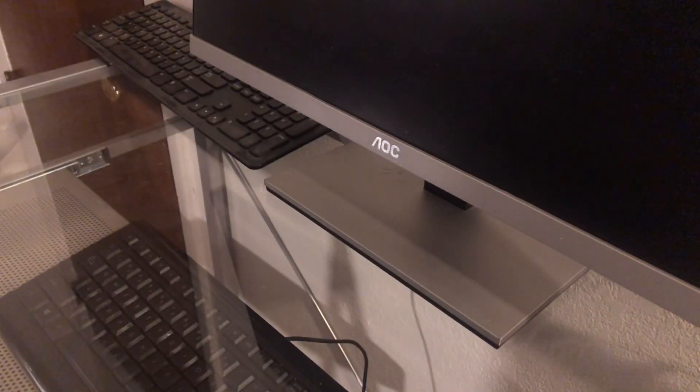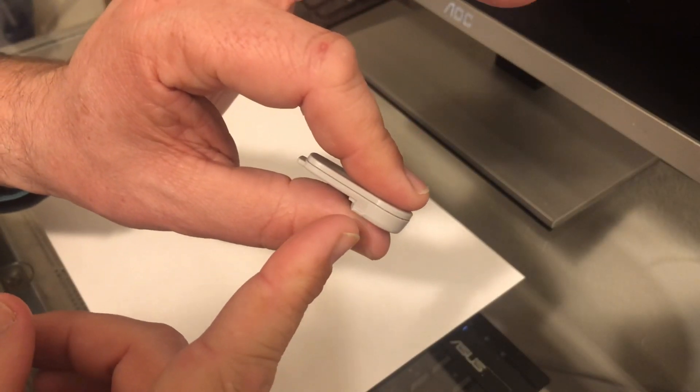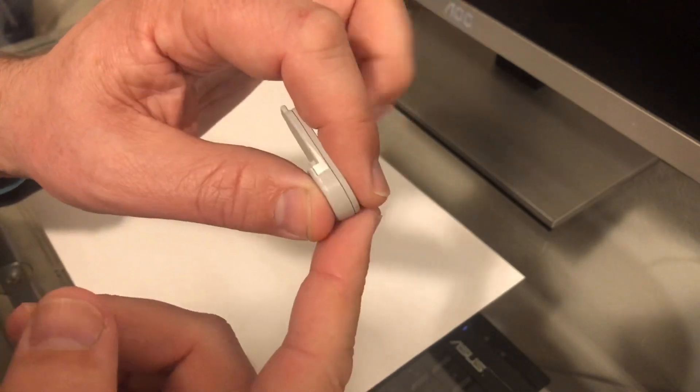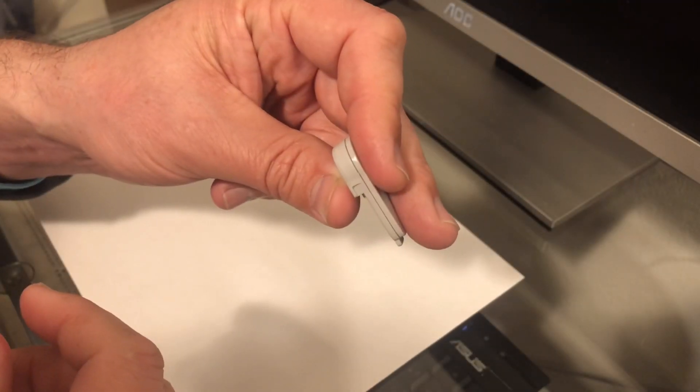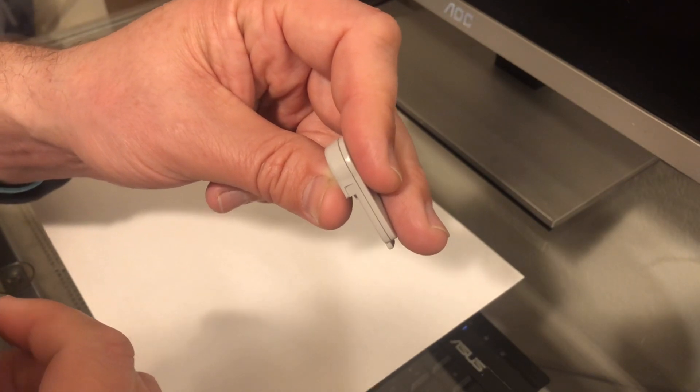I'll put a piece of paper on the desk so this is a bit easier to see. There's a little notch right here where the transmitter clips into the sensor — there's one of these on each side. Once engaged, that notch is meant to hold the transmitter in place so that you cannot reuse your transmitter. We're going to fix that.